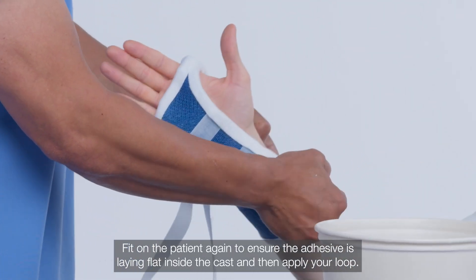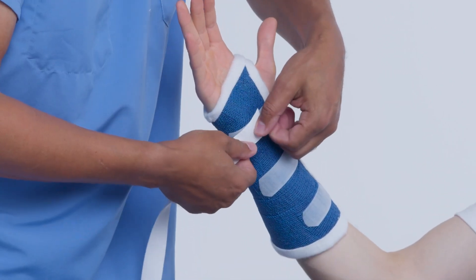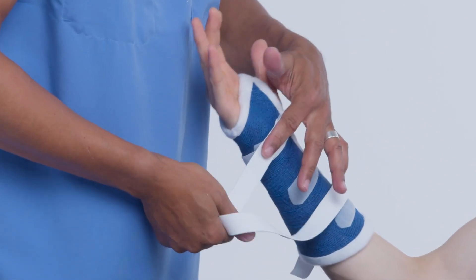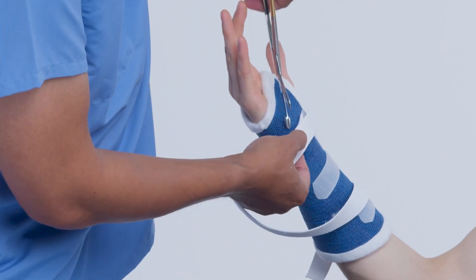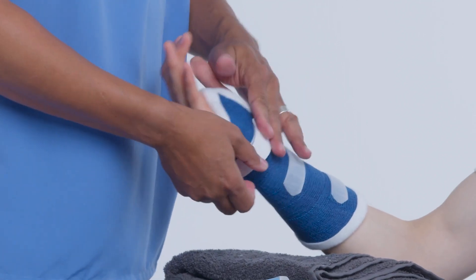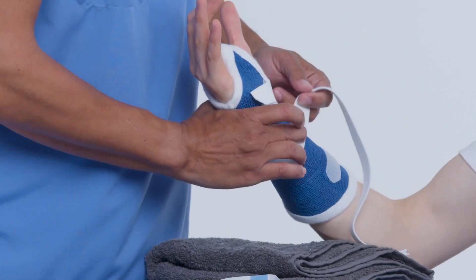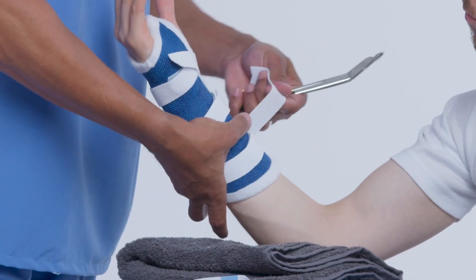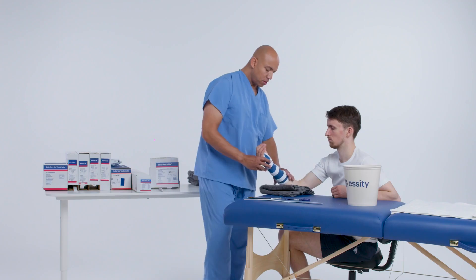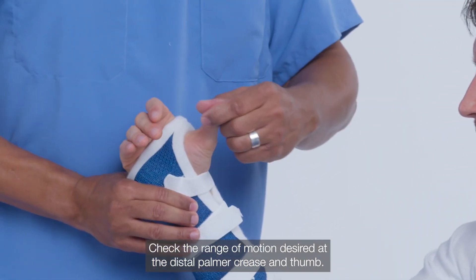Fit on the patient again to ensure the adhesive is laying flat inside the cast, then apply your loop. Check the range of motion desired at the distal palmar crease and thumb.